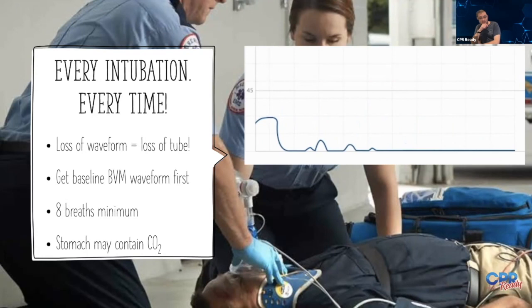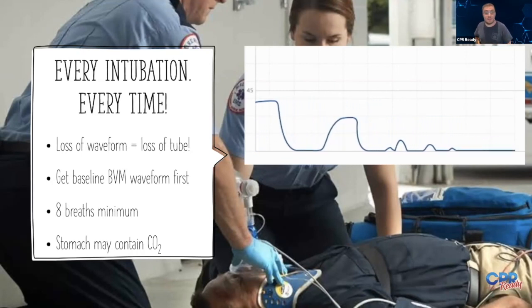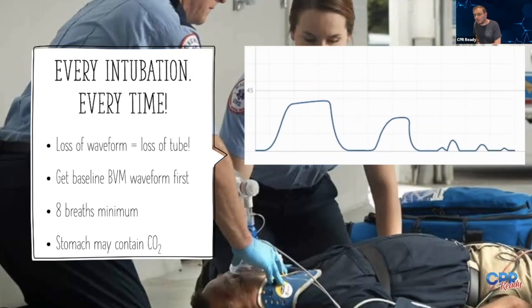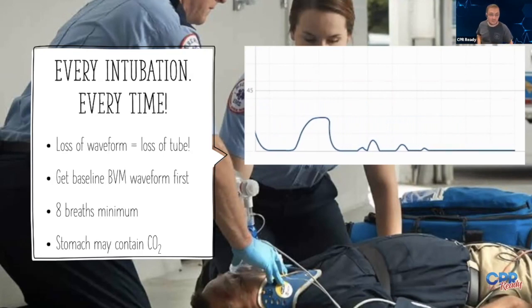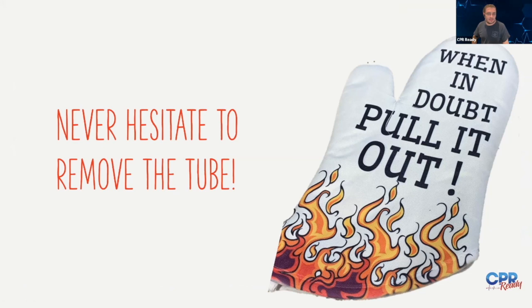Sometimes if you do have an esophageal intubation, you might get those little blips like you're seeing at the end there. So you might see little ones at first, especially if they've had a carbonated beverage. If they've had a soda before they got intubated, you may have a little bit of CO2 in the stomach. So when you first bag, and if it is in the esophagus, you might get some small wannabe waveforms there, but within 8 breaths, those are going to disappear if it's from the stomach. So be sure you look at it more than just for a fraction of a second right after the tube goes in, so you make sure it stays nice and regular. Never hesitate to remove your tube.